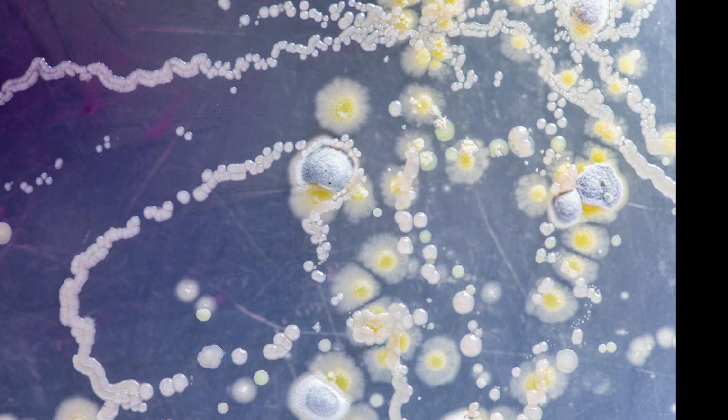We also discussed whether we can enhance the appearance of the Haemophilus influenzae disc diffusion plates, and we know that excess moisture in the media may cause fuzzy zone edges or haze within zones. So if you're not drying plates, maybe it's a good step to dry them and then repeat the reading exercise to see if that would make a difference. And it's never a disadvantage to dry the plate as long as you follow the drying instructions and do not dry them for several days, of course.